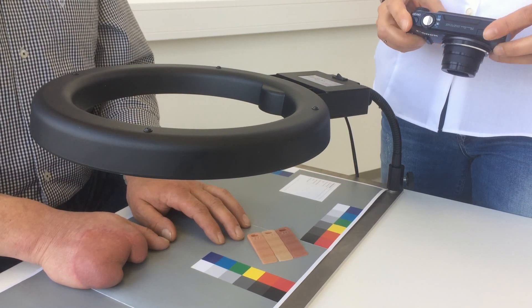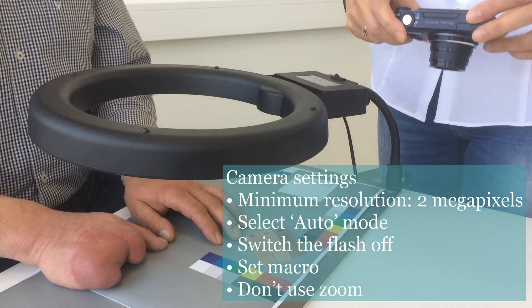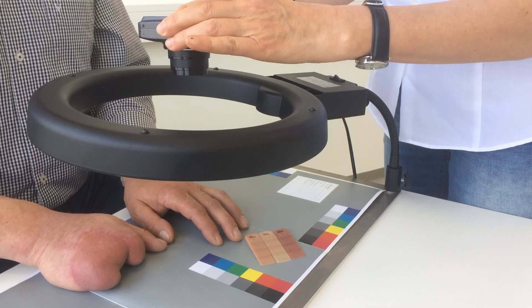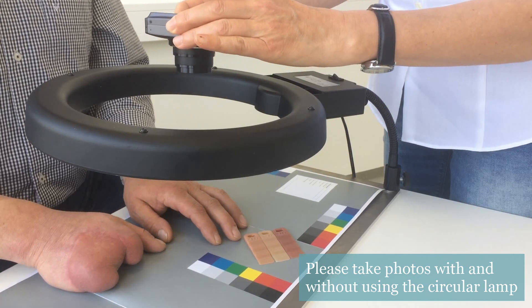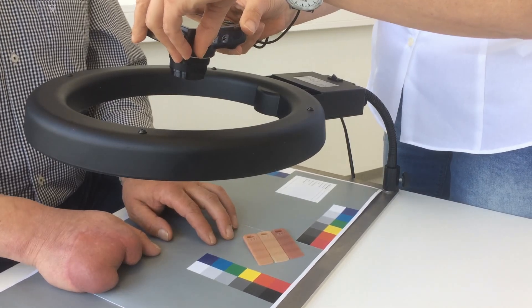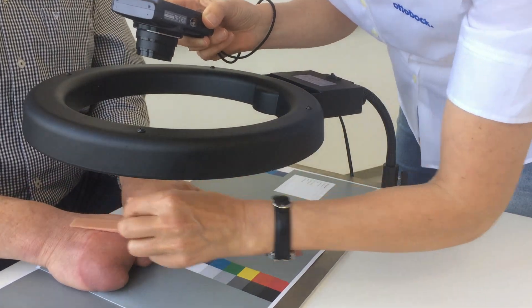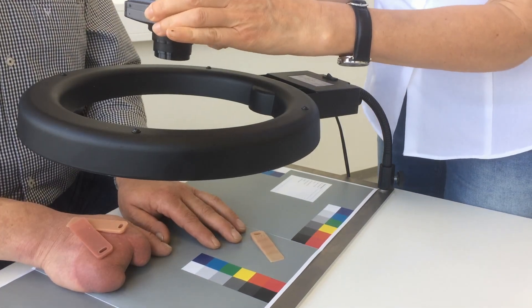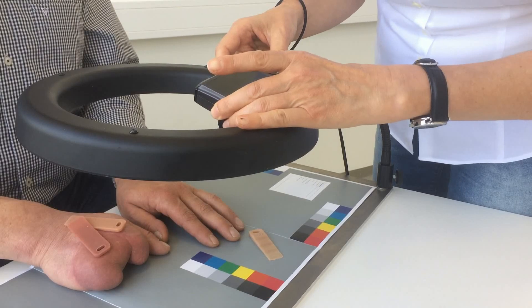After all the skin tones are selected, I photograph the hands with the color samples. Be sure the camera is set properly. Both hands should be resting on the color determination sheet so that at least one of the color scales is visible. I take the photos through the circular lamp using the bird's eye perspective, making sure to photograph both hands from all sides. I follow the same procedure with the color samples placed right side down on the back of the hand. Remember to take a close-up of the fingernails — without nail polish, please.